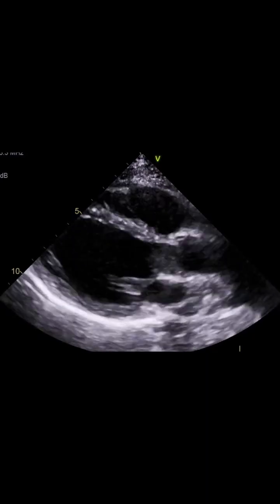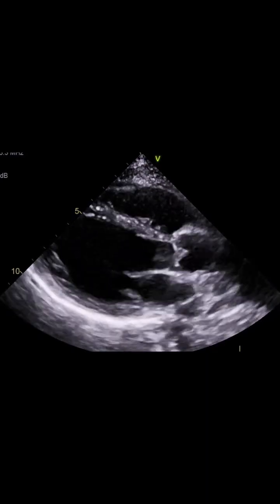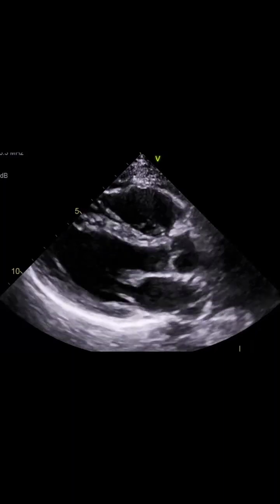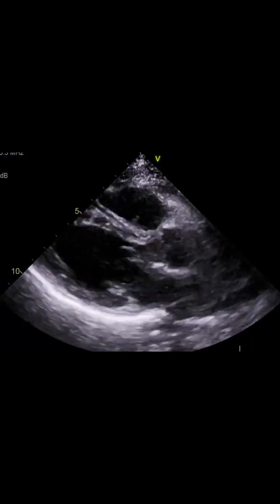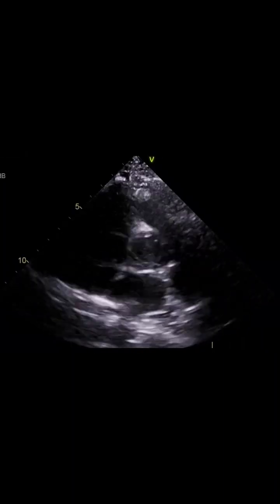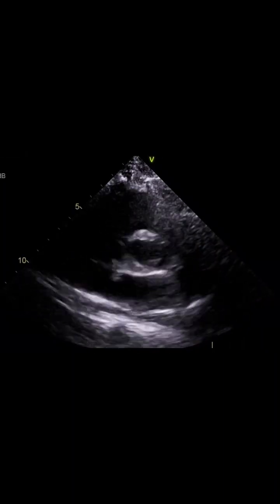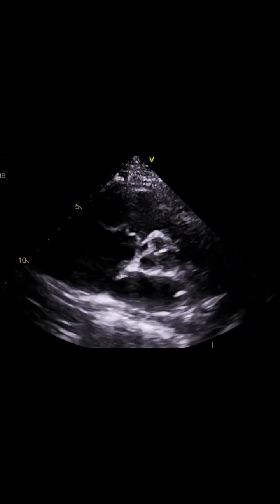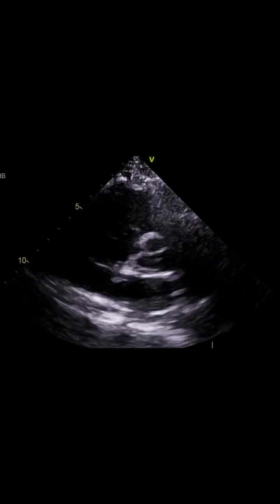Take a look at this parasternal long axis view with a normal aortic root. Normal short axis at the aortic level — the aortic root is perfectly round and the three cusps close in the center.